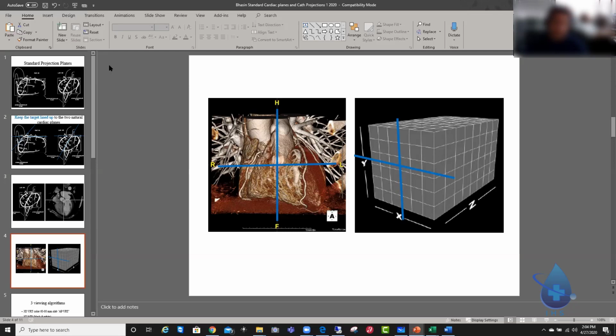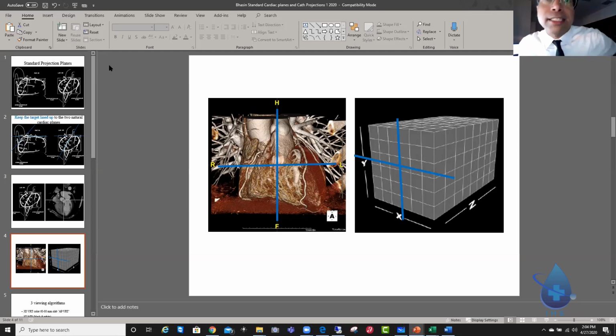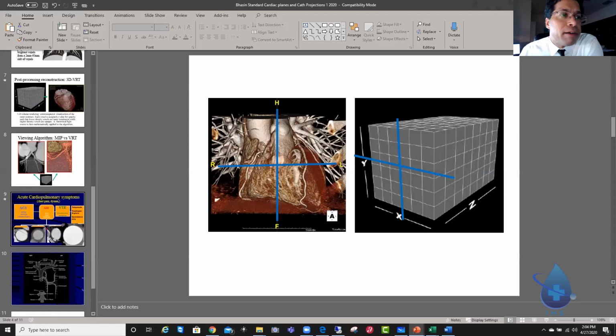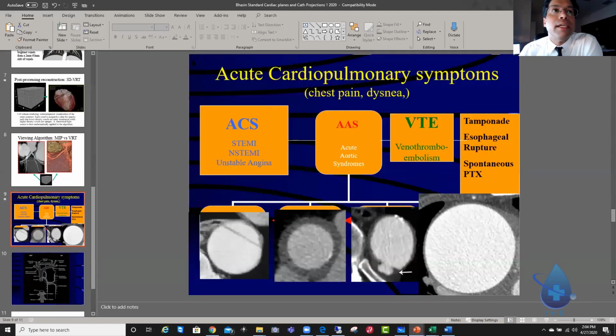Okay, guys, we've got to get this straight right now. Let's be very clear. There are 4 clinical acute aortic syndromes. Each one has a characteristic imaging finding that you'll see on the CT scan, and you want to be crystal clear about these. They have to be burned into your memories.